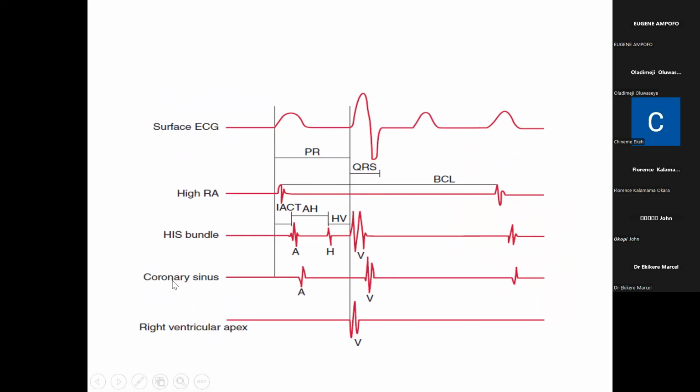There's a catheter in the coronary sinus, which I also showed you, that is monitoring the activity between the left atrium and left ventricle. And I said there's usually a catheter also in the right ventricle. Hope this is clear, because everything you'll now be seeing on the tracing, this is what you'll be seeing, to now identify the wave pattern to make your diagnosis.